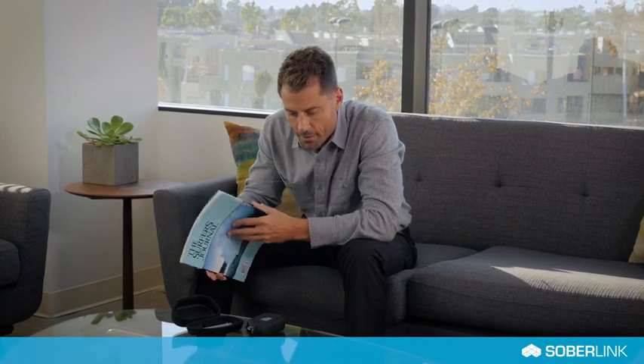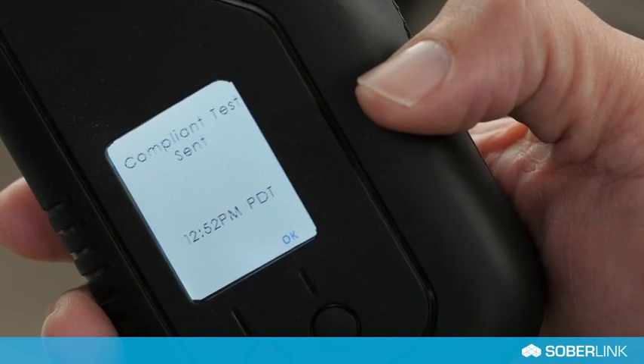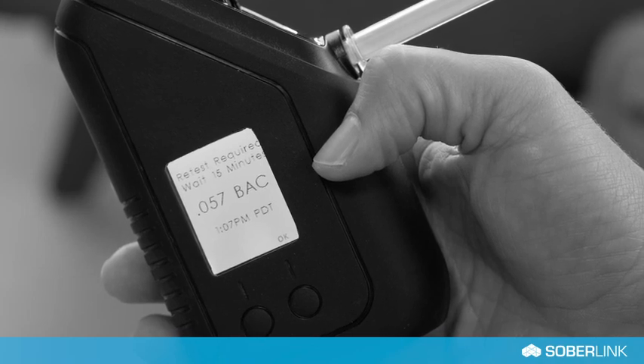The test results will take approximately 60 seconds to display on the device screen and send to the SoberSky web portal. After a positive BAC is received, wait 15 minutes before submitting another test.